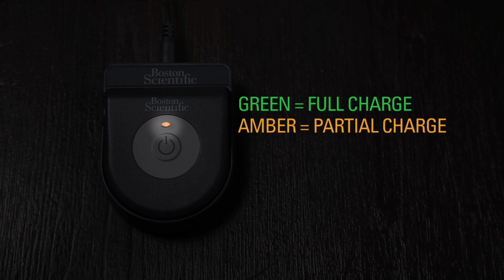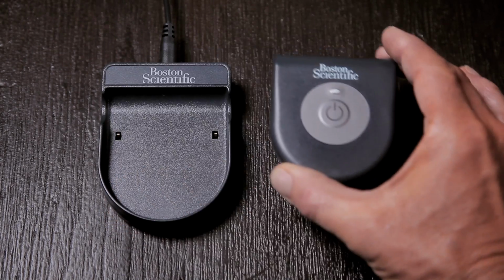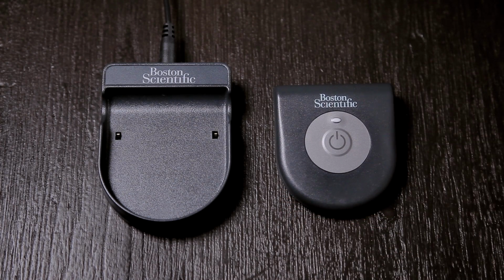But when the light turns amber, it means the charger is only partially charged. When this happens, the charger can still be used for charging, but may not be able to fully charge your stimulator. When you lift the charger off the base station, the indicator light always goes off. So be sure to check the light before removing the charger from the base station.